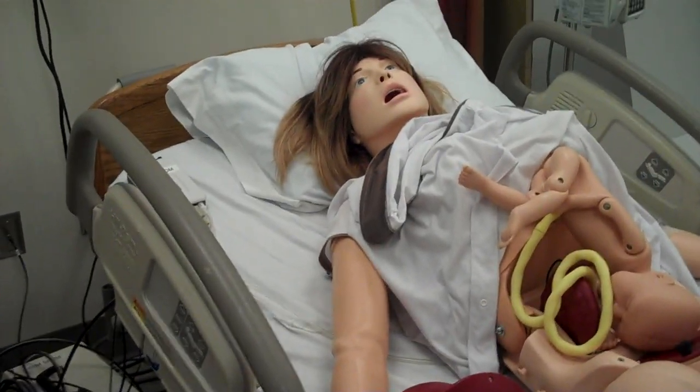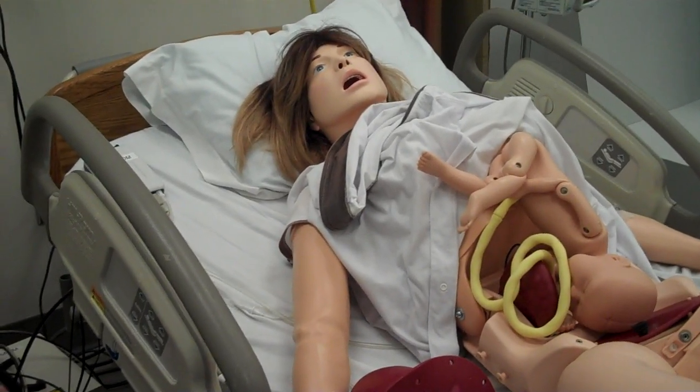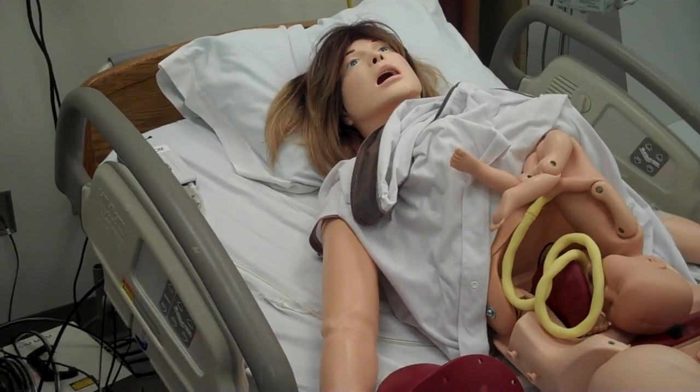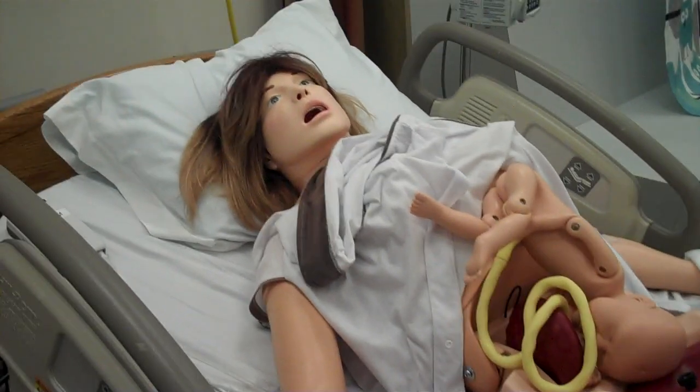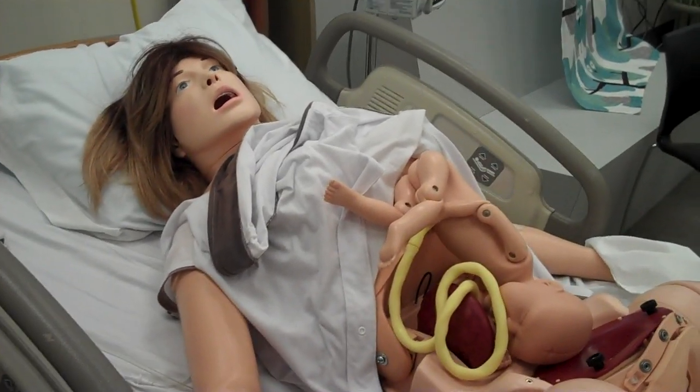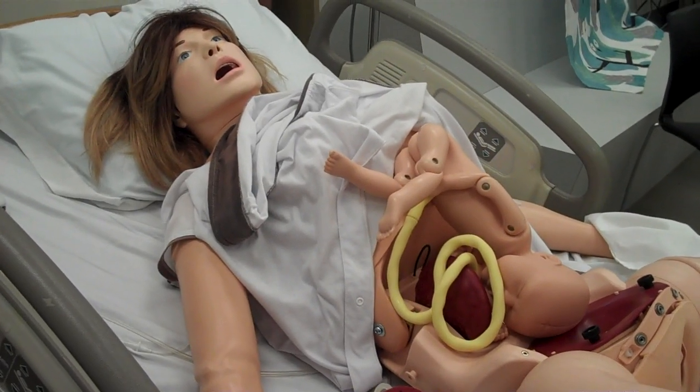Okay, with the help of Sim Mom here, she's kind of taken apart, but it's for me to help show what goes on in some obstetrical emergencies that we're going to talk about. The first emergency we're going to talk about is a prolapsed cord.